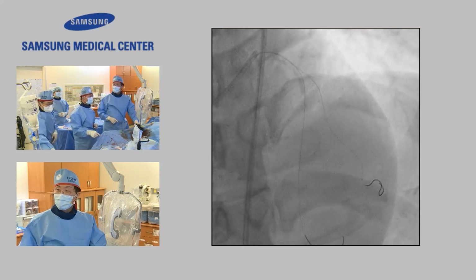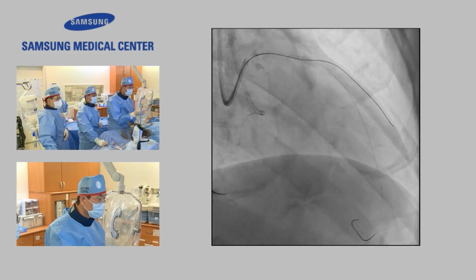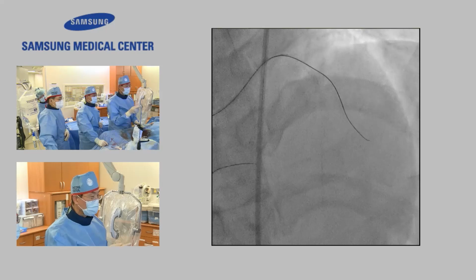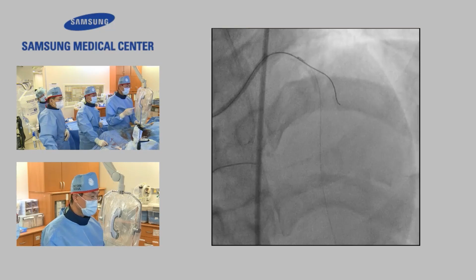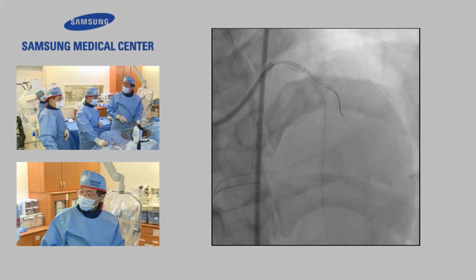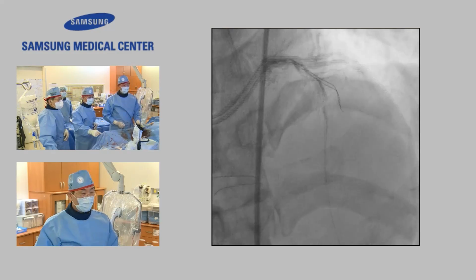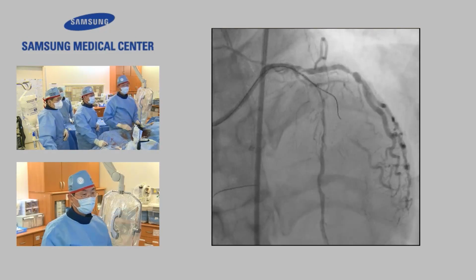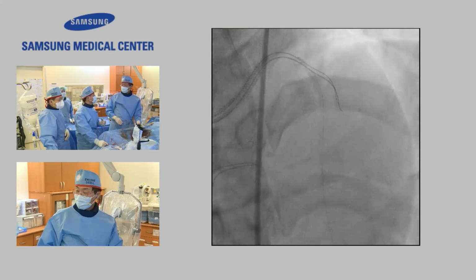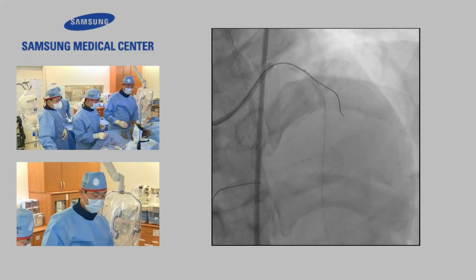Yeah, I forgot that actually. Previous angio. I forgot that. Previous. No. Here. Actually, what we see is not lumen, but calcification, right? In the CT angiography, there was calcium at this point. This is calcium, not the contrast. Yeah, not the contrast. This was calcium. So it's true position.